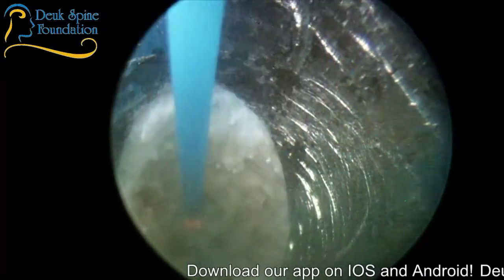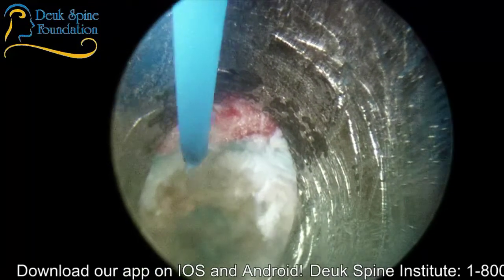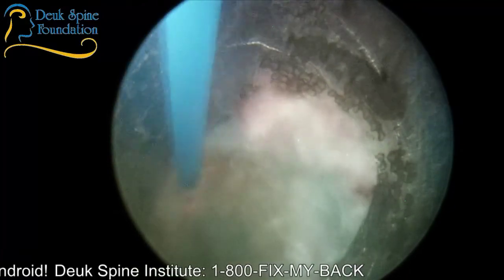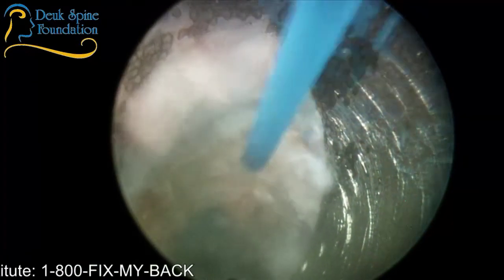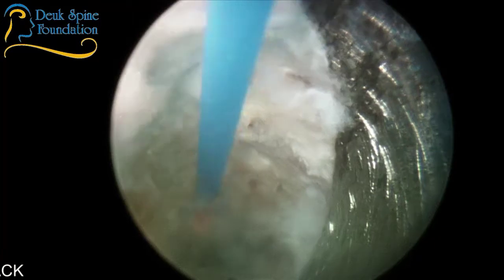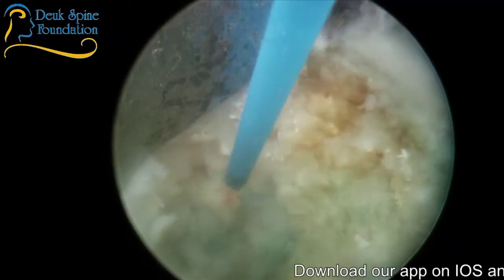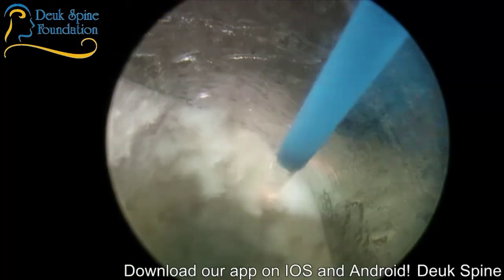Great questions, by the way, and I appreciate the audience asking questions. That's how you learn. All right, so this is it right here. I'm looking at the 12 o'clock position, the epidural fat. The traversing nerve root will be right up there a little bit further. The exiting nerve root is to my left at 9 o'clock, and I'm going to show you that nerve in just a second. That's going to be the left L5 nerve root. That's the one that was getting bothered, irritated by the herniation, and you're going to see that nerve in just 1 minute. Sometimes it's covered with fat. Not much I can do about that. I'm not going to mess with it, but hopefully in her case it won't be.